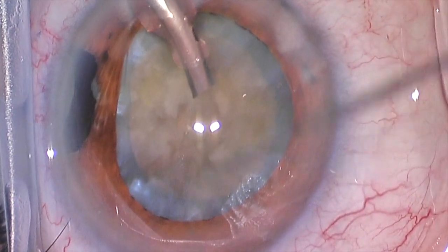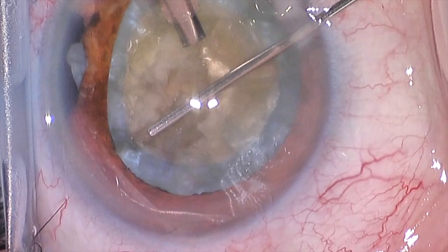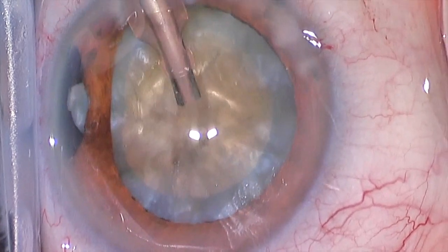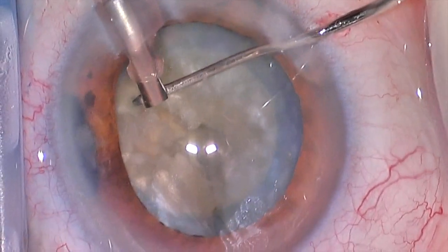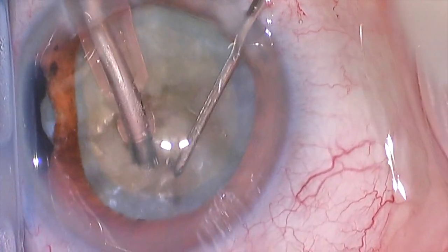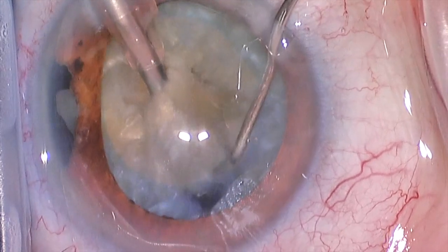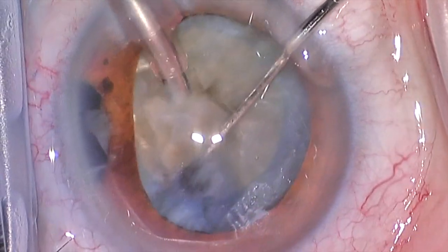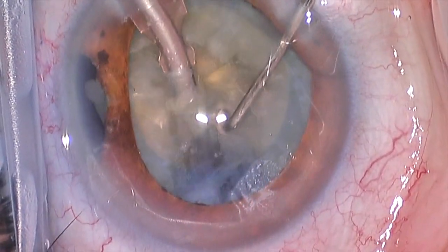Because the air bubble is gone, that's my indication that there's less viscoelastic in the eye than I want, so we'll reinflate the eye with the viscoelastic substance. The viscoelastic protects multiple structures of the eye — the iris, the capsular bag, and most importantly the cornea. The cornea has a layer of cells that function to keep it clear so that you see well. The ultrasound energy we use to break up the lens into little pieces can actually damage the corneal cells. So we use more viscoelastic, especially in denser lenses like this one.